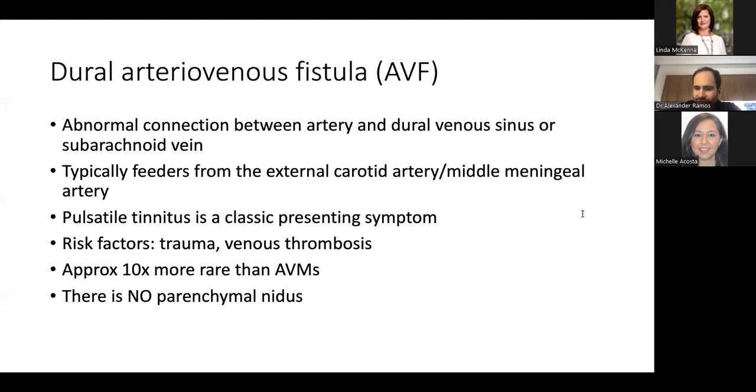Oh yeah, those are great questions. So the question was why we treated that intranidal aneurysm with glue rather than a coil. The reason we don't usually glue aneurysms in general is because we don't want the glue to fly into precious brain.